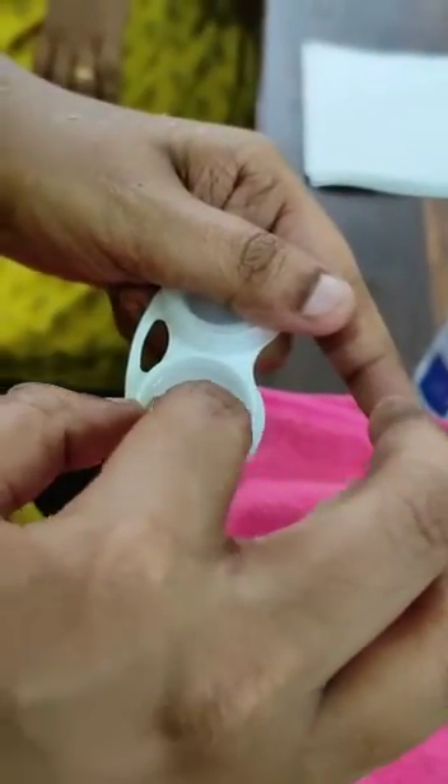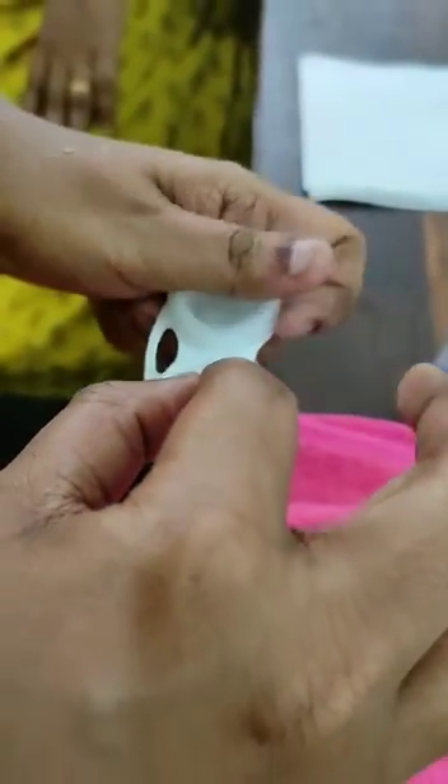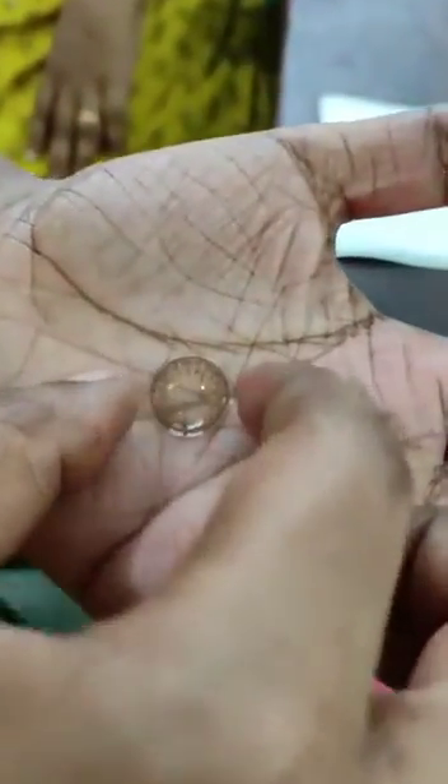Now take the lens out of the lens case. Keep the lens in the center of your palm and clean it using a saline solution for 5 to 10 seconds.